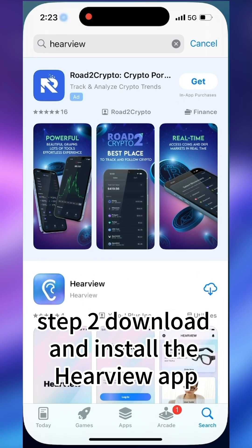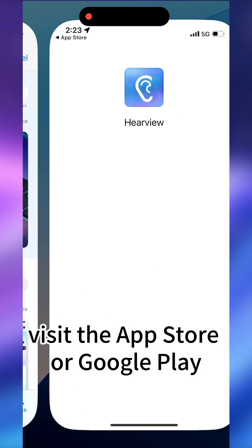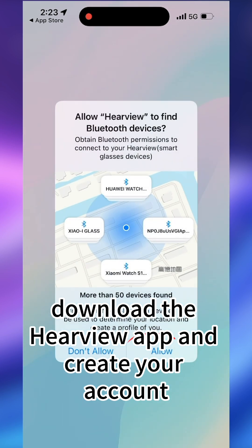Step 2: Download and install the HearView app. Visit the App Store or Google Play, download the HearView app, and create your account.